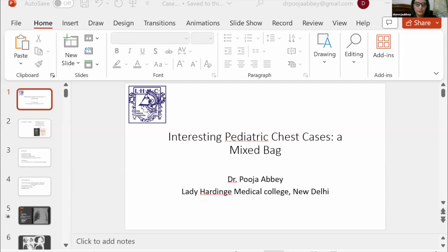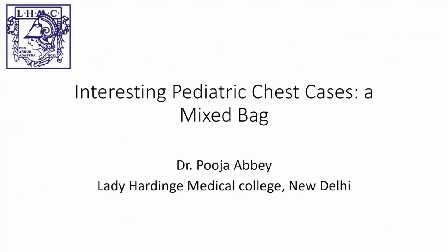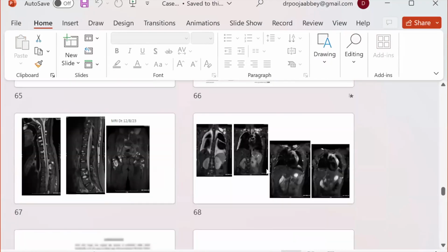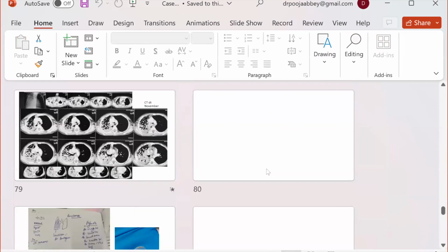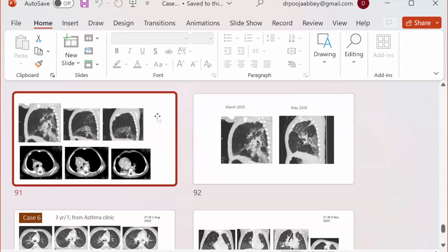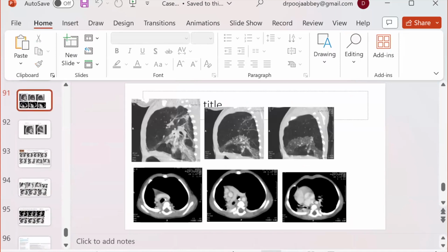Usually they say that we should use as little contrast as possible, and if we are getting any sort of aspiration or evidence of a fistula, then we should probably stop immediately. The other thing that we can do is use isoosmolar contrast like iodixanol. Even if that gets aspirated, since it's isoosmolar, it won't draw a lot of fluid. So that may be another thing that we can use.